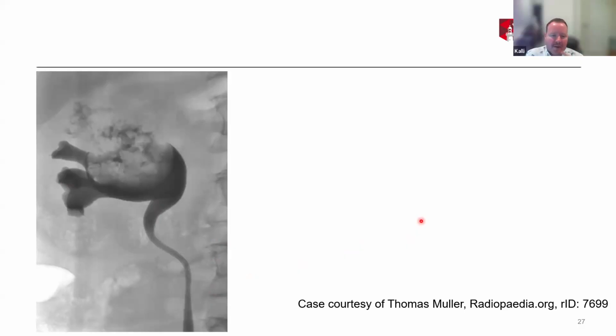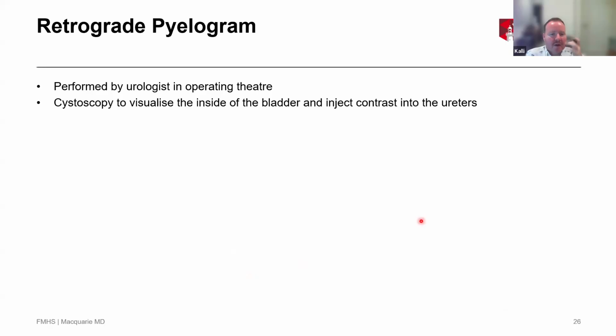Yeah, just going back. Thanks for that. Yes, quite fun doing these procedures and being our own radiologists. But going back, there was a question. People apparently have gold mines in their mouths, lots of different kinds of metallic implants. Is that a problem at MRI?